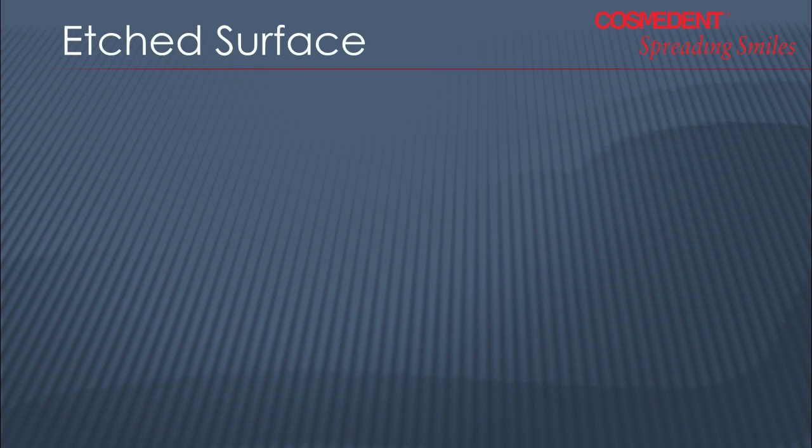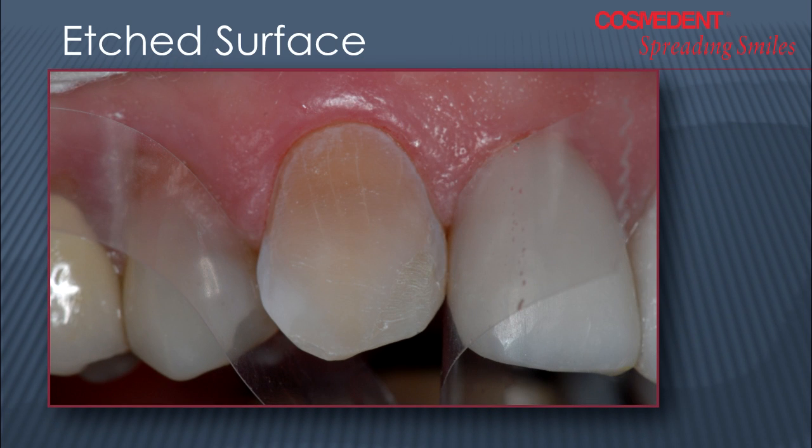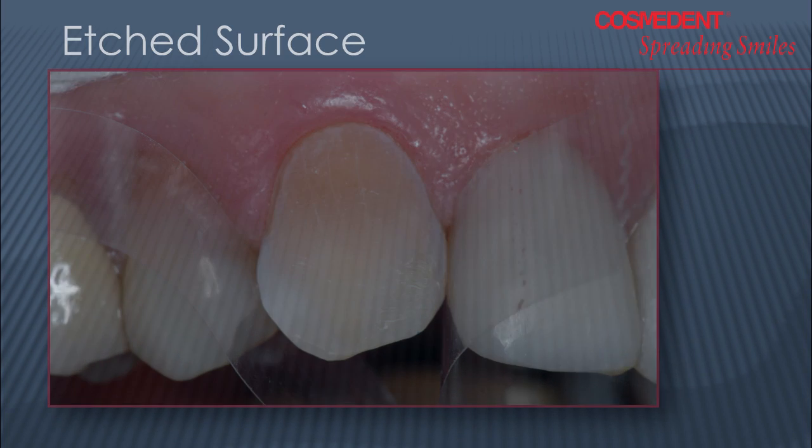If you look at the etched surface of this tooth — this is after etching with phosphoric acid — you can see that the entire prep is in the enamel surface. That's what we're attempting to get. Sometimes we don't achieve it, especially in canines, but here I've managed to keep my prep entirely in the enamel surface, and that's what we're looking for.